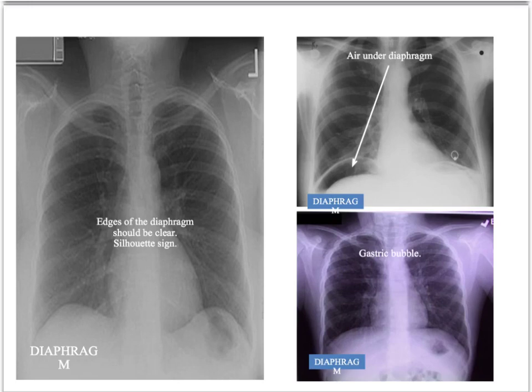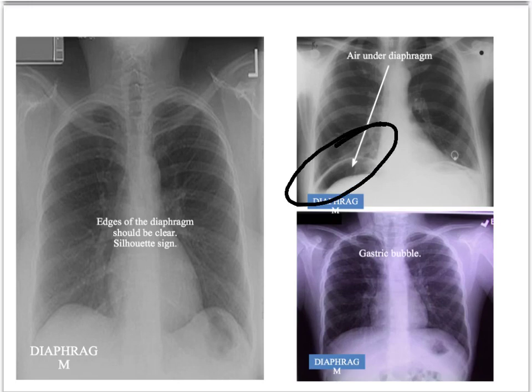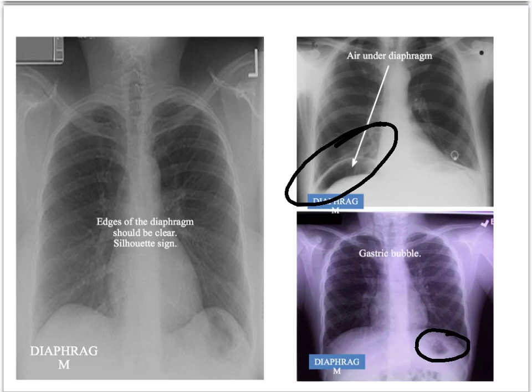Another important diaphragm sign to look for is air under the diaphragm. This is an abnormal finding — you should not have air there. What you may normally see is a gastric bubble, which is normal. But if you clearly see air under the diaphragm, that is abnormal. Remember, a patient showing this sign likely has an acute abdomen, so the finding may not completely surprise you.